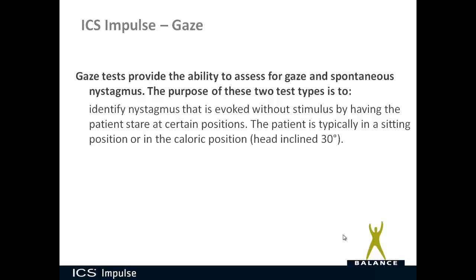The gaze test and spontaneous test provide the ability to assess for gaze and spontaneous nystagmus. The purpose of these two test types is to identify nystagmus that is evoked without stimulus by having the patient stare at certain positions. The patient is typically in a sitting position or in a caloric position, where the head is inclined 30 degrees.